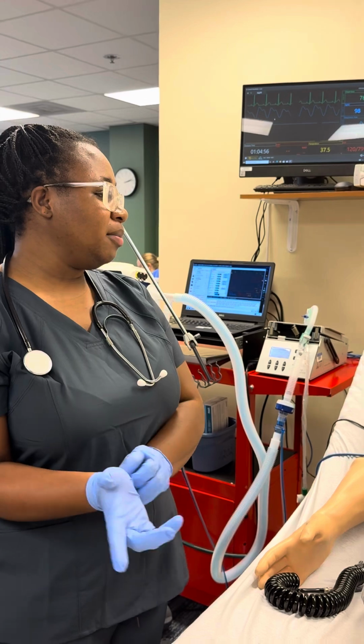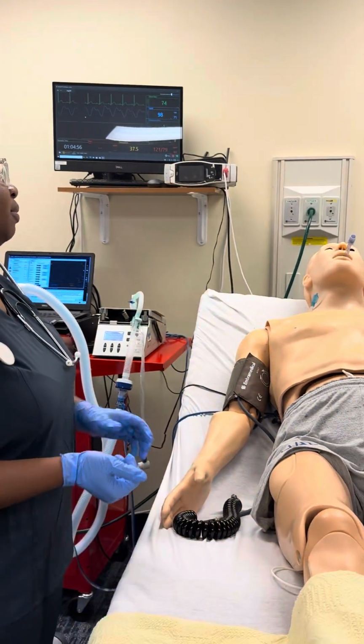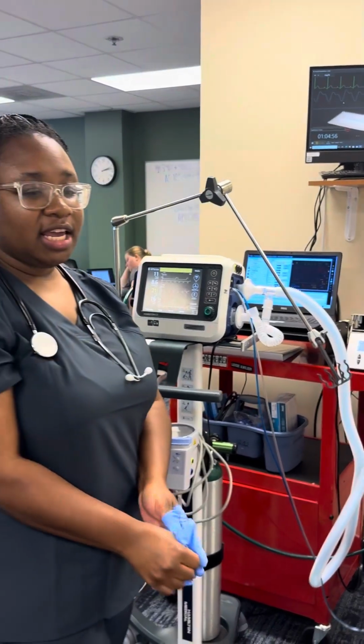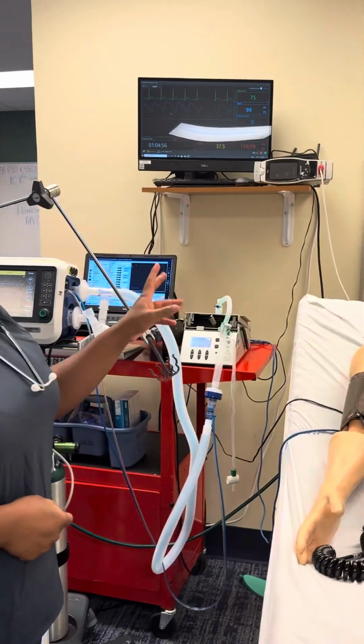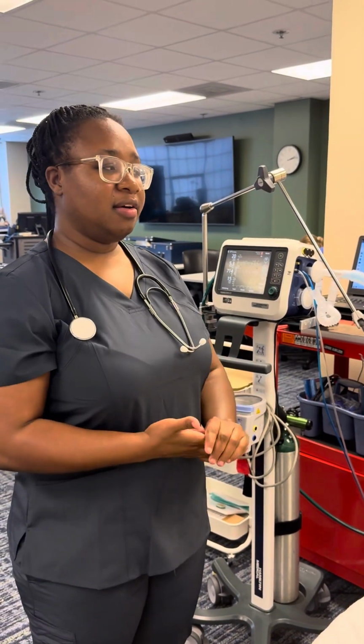And now I'm going to make sure patient is fine, make sure Miss Haley is fine. I'm going to take off my gloves, wash my hands, and chart everything, such as the ETT placement, vitals, breath sounds, any changes that I made with the patient. And that's it.